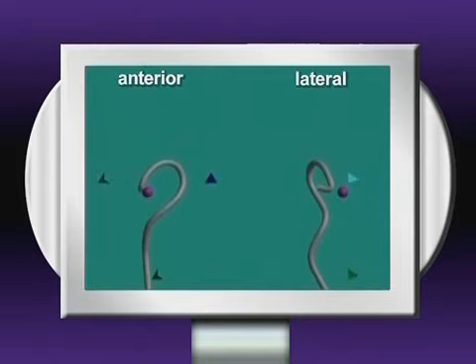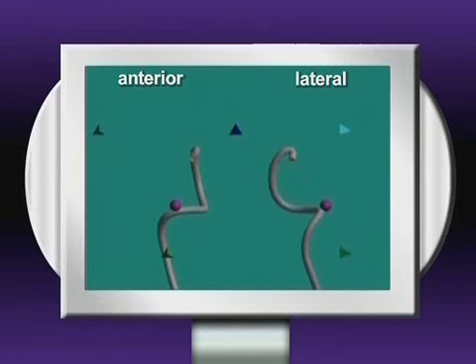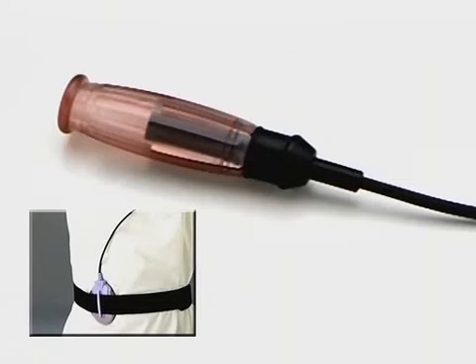Scope guide can easily be switched to show the lateral view as well as the usual anterior view. This combined view shows the 3D shape better. It also helps decide whether a loop passes sufficiently anterior to allow hand pressure to compress it. If in doubt, a hand coil can be used by the assistant to target the exact point which best opposes the loop and makes scope insertion more efficient.